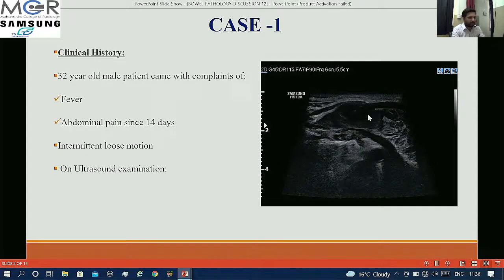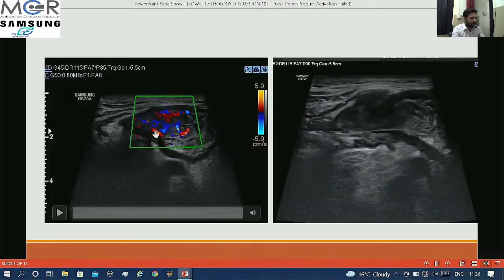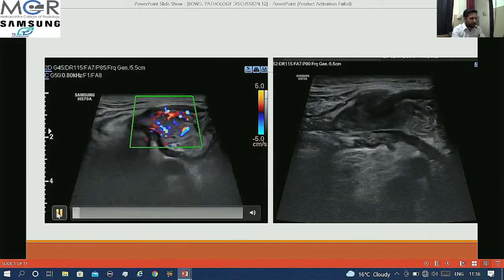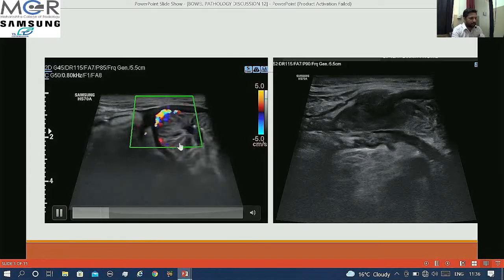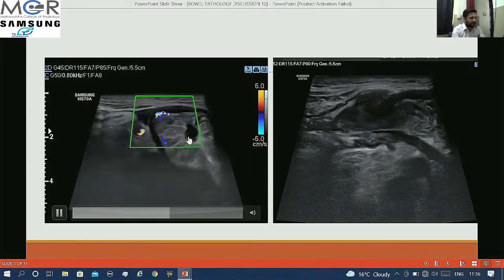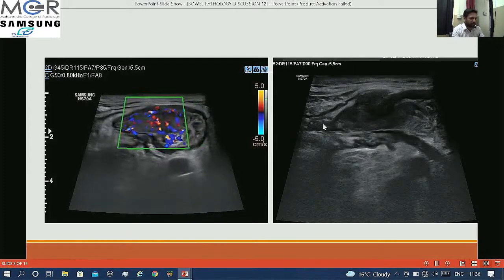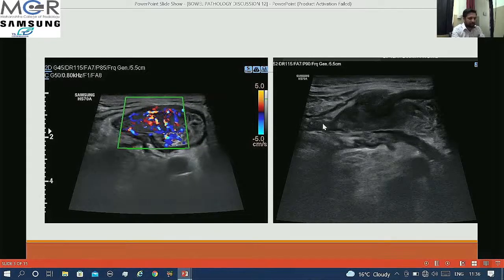On ultrasound examination we can see that there is a segmental bowel wall thickening, predominantly hypoechoic in appearance. On color Doppler we can see significant raised vascularity within, as well as a few sub-centimetric lymph nodes.